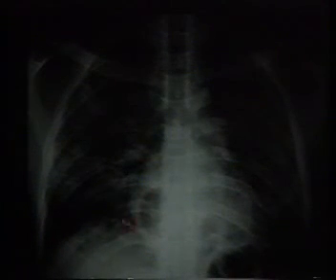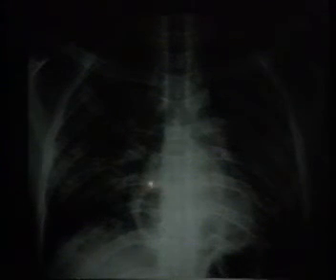And the patient, as you can see here, has an air cyst or a loculated pneumothorax or pneumomediastinum, which is contained within the region of the inferior pulmonary ligament. The patient developed a spontaneous pneumothorax, and we placed one of our small catheters, which is rather difficult to see, into the pneumothorax in an attempt to drain the air collection. However, the patient deteriorated clinically, developed worsening ARDS, and required intubation with mechanical ventilation.